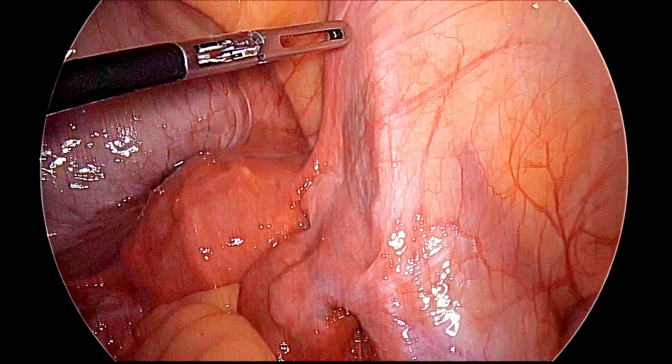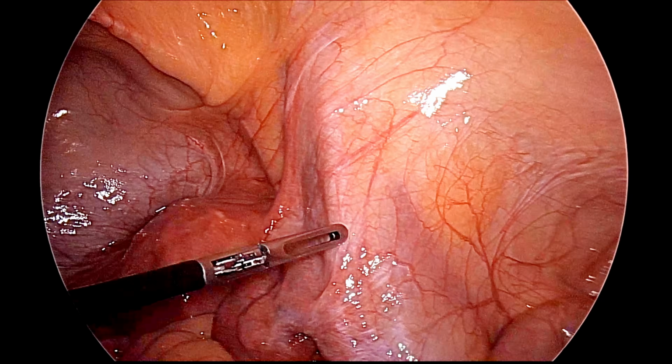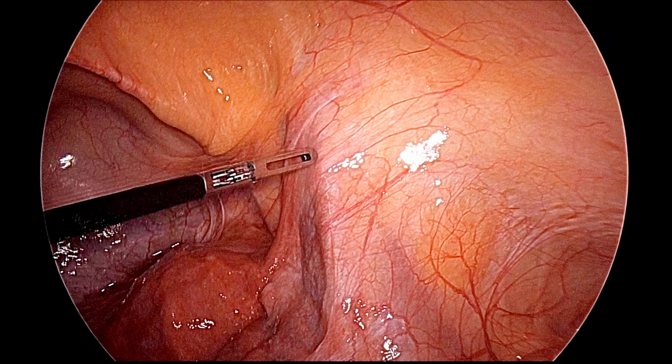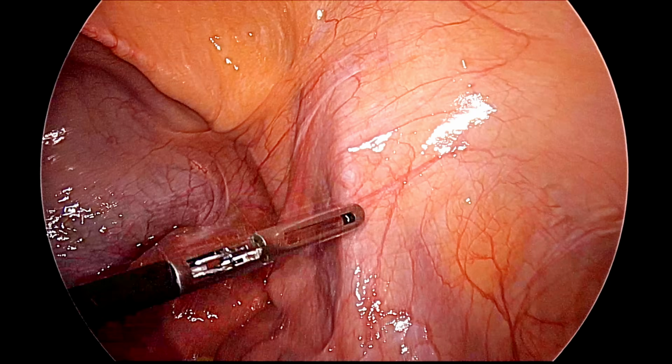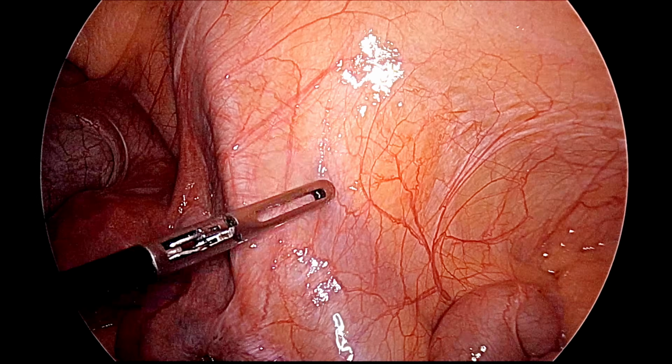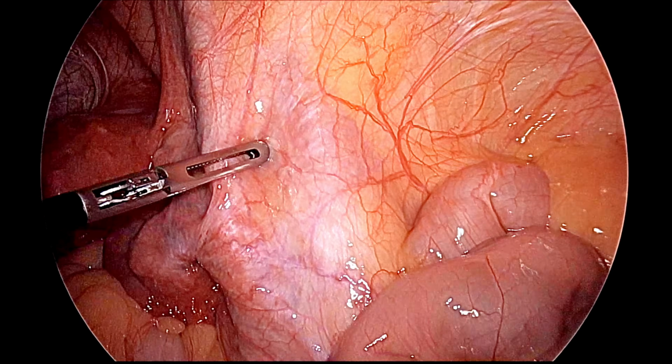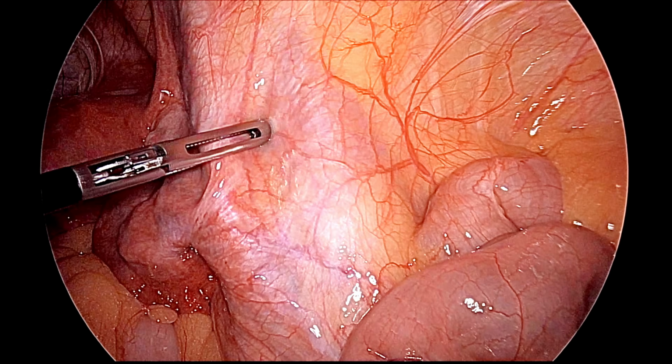Here is the IP ligament, and this is the triangle of doom. The apex is the deep ring, medially the round ligament, and here you can see the deep ring where the round ligament finishes. In this area, this is the psoas muscle, and here is the GFN, the genital branch of the genitofemoral nerve, which will also be visible.